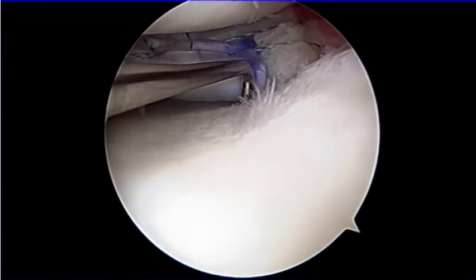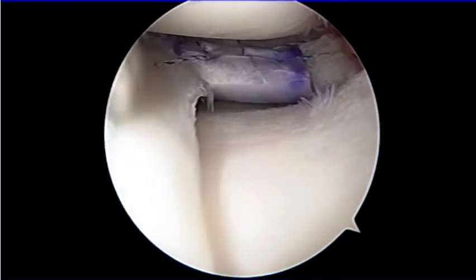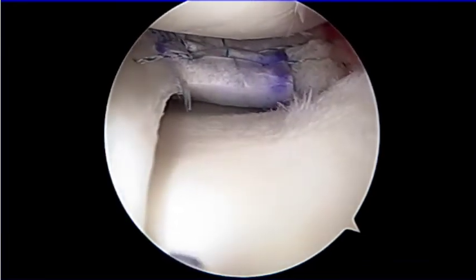The stability of the implanted scaffold was confirmed with probing and knee motion.